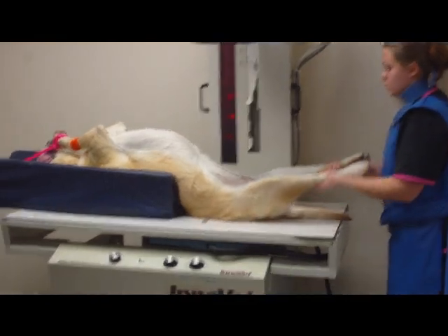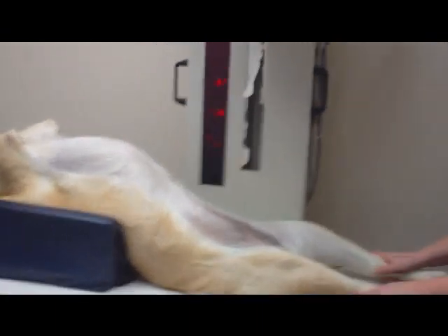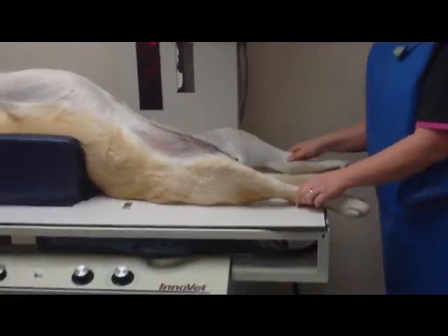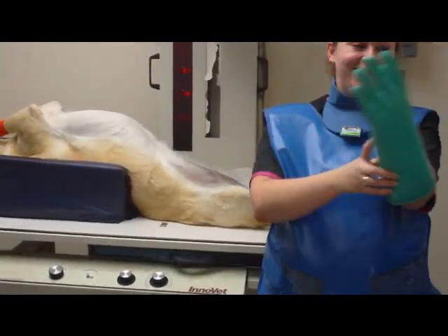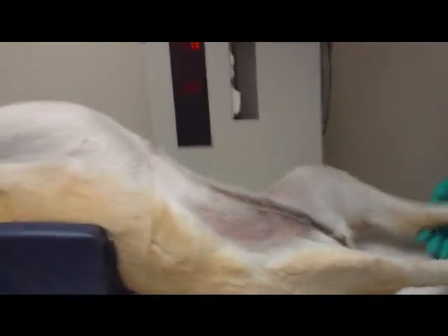I measure her for a VD x-ray and get the mAs and kVp settings for my machine. I extend her hind legs, holding onto the tarsal joint. As I am extending, I rotate the stifle joints inward towards each other. Then, after properly positioning the animal, I shoot the x-ray.